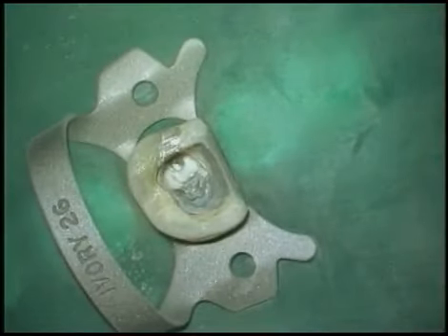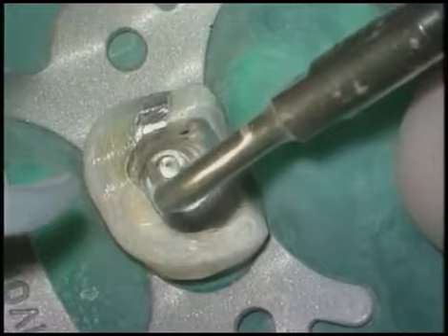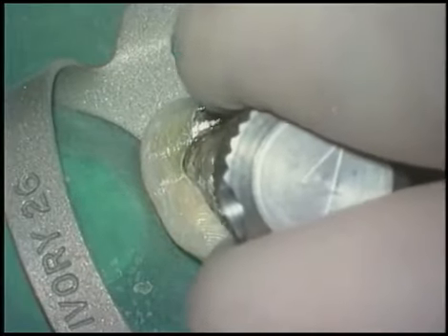Well, we just sheared off the post. Now we need to go back to ultrasonics trephining procedures, albeit more apically, so we can employ a smaller trephine and tap from the PRS kit. Again, turn the tap in small counterclockwise rotations to draw it down.